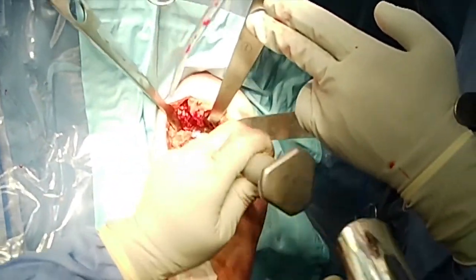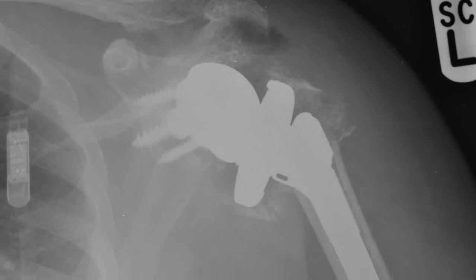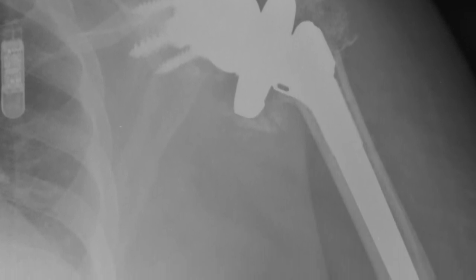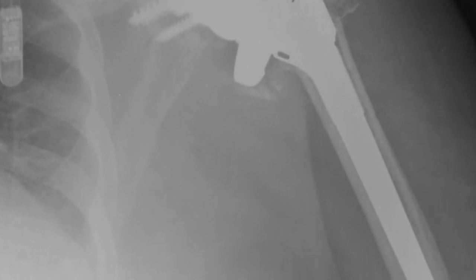Post-operative radiographs show satisfactory alignment of the glenosphere and the rest of the prosthesis. Please visit my website and my YouTube channel for more videos. Thank you.